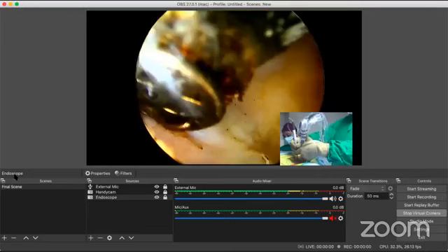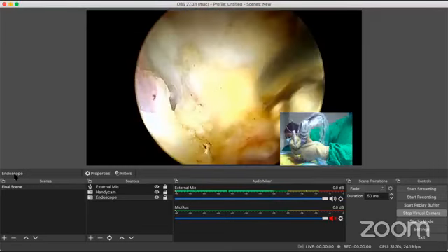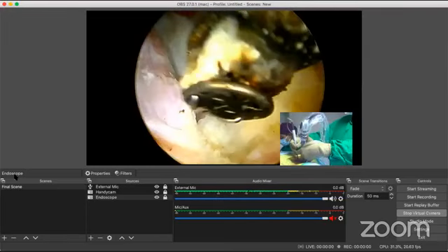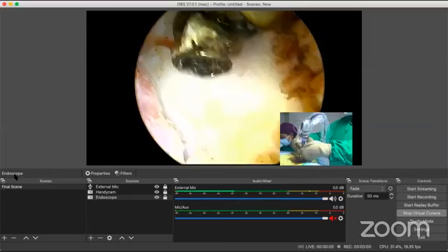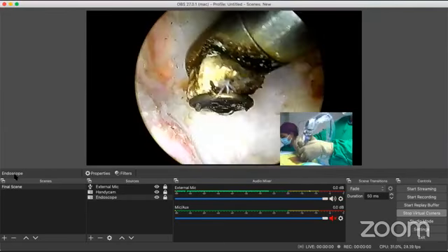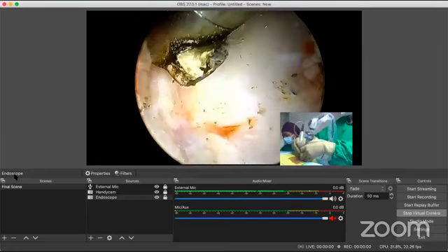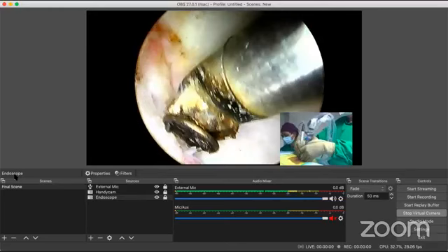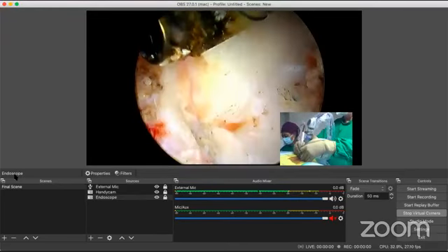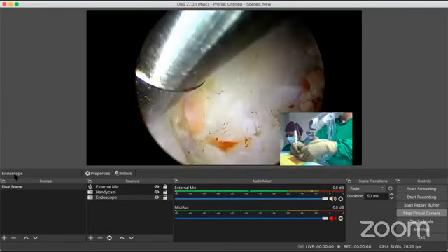You see, there are facetal arteries and they bleed. So you need to be careful. But you can see how I've opened up the facet joint also now. This is a facet joint which I've opened up. And this is a lamina which is coming down and forming the V over here. So we'll take one more shoot if you want to. I'll demarcate the V to you, satisfy you before I start with my burring process.